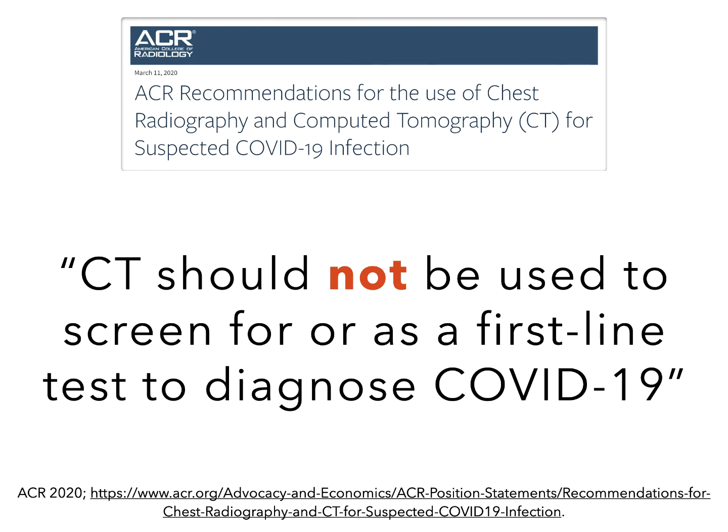The consensus by North American radiology specialist societies is that CT shouldn't be used as a routine test for these patients. For one, if you send a known COVID or suspected COVID patient to CT, it takes anywhere from 30 minutes to 2 hours, depending on your institution, to properly clean and disinfect the scanner for the next patient. Second, you're exposing a lot of other healthcare workers to the patient, including the porter, possibly a nurse, and the CT tech. Third, you're taking a valuable resource that may be needed more urgently for another patient who's having a stroke or an aortic dissection or is in a high mechanism trauma.